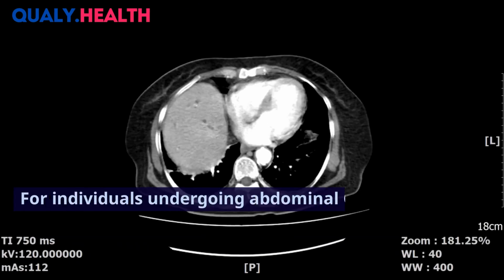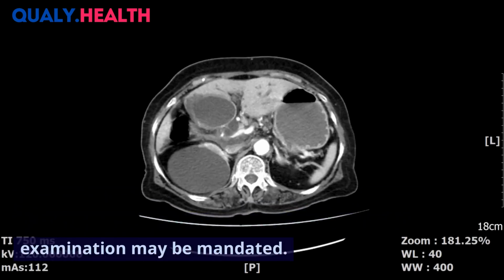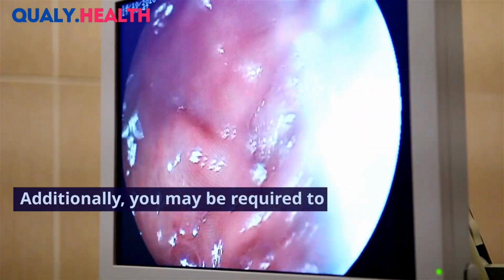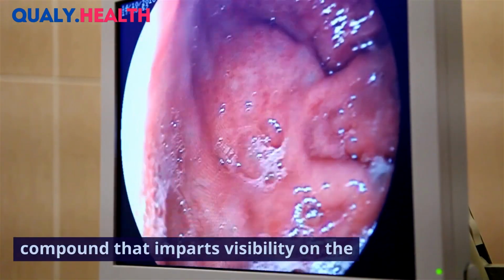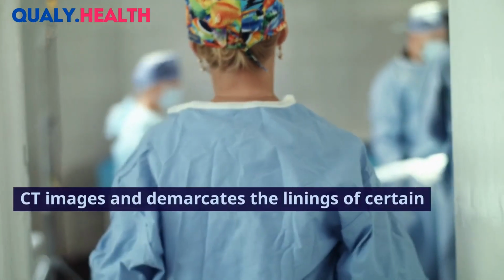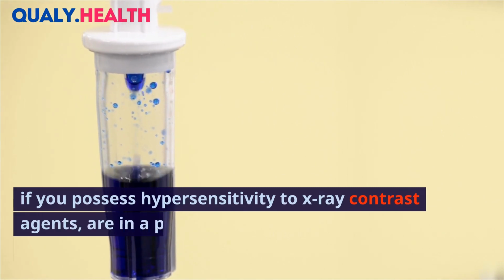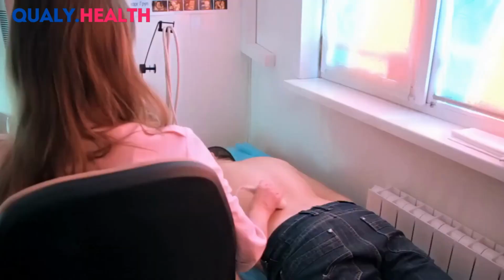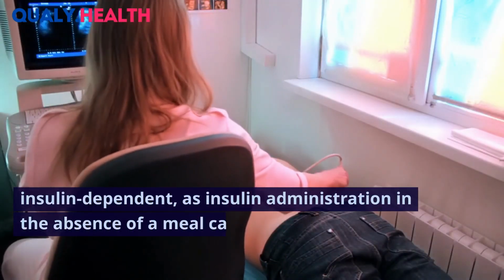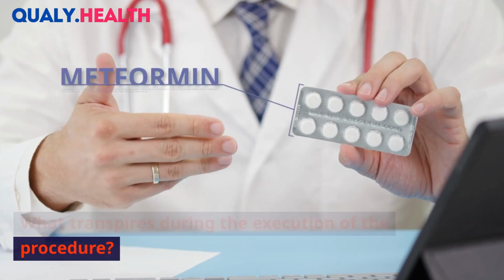For individuals undergoing abdominal CT scans, fasting for a duration of 2 to 4 hours prior to the examination may be mandated. Additionally, you may be required to consume a copious amount of oral contrast, a fluid compound that imparts visibility on the CT images and demarcates the linings of certain internal organs. It is imperative to apprise your healthcare provider if you possess hypersensitivity to X-ray contrast agents, are in a potentially gravid state, or have diabetes, especially if insulin dependent, as insulin administration in the absence of a meal can precipitate hypoglycemia.